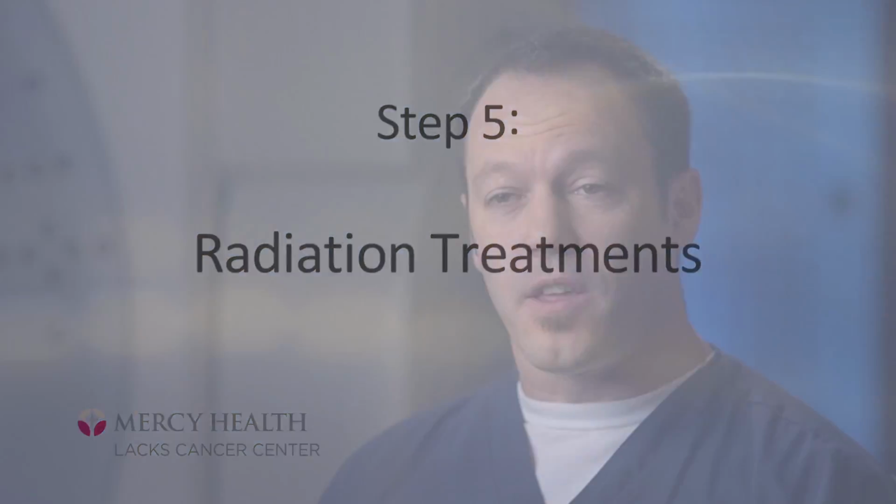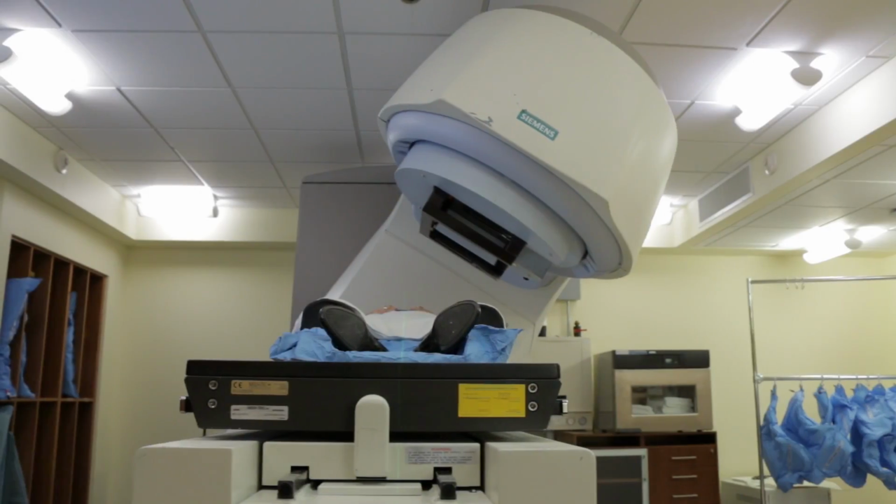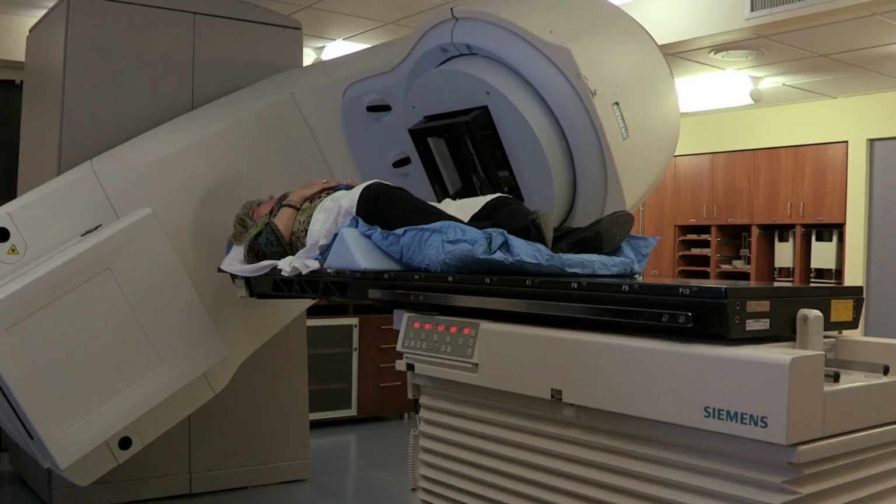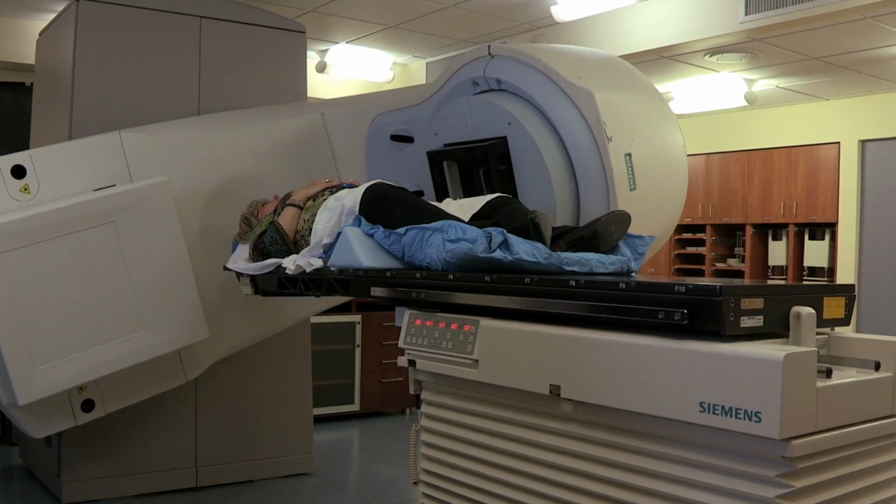During the treatments, you won't feel anything. You may see the machine rotating around you. You hear the machine buzzing at times when it rotates around you. Sometimes you'll hear odd pops and clicks. But nothing to worry about, nothing will touch you, and you won't feel anything.